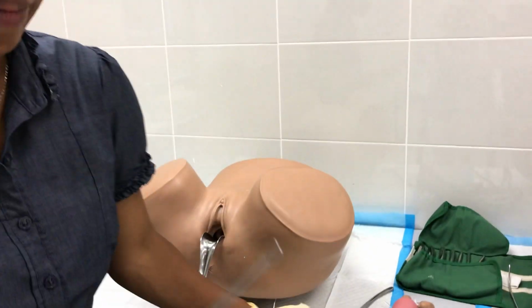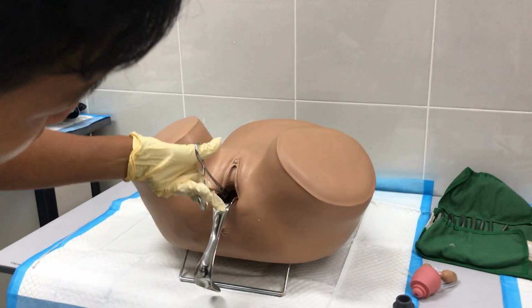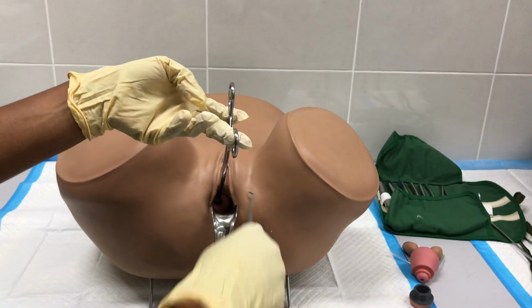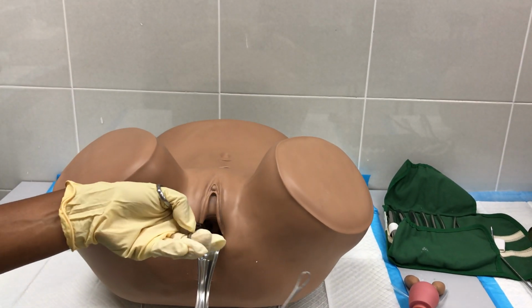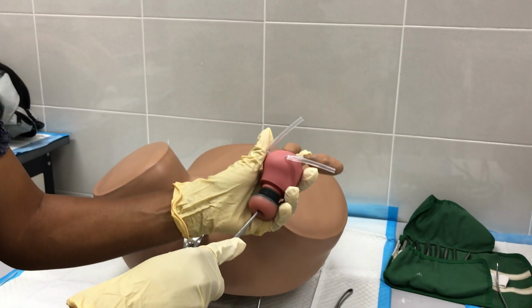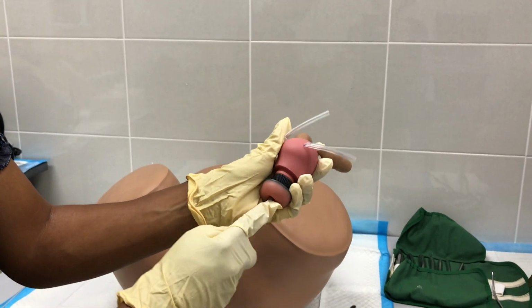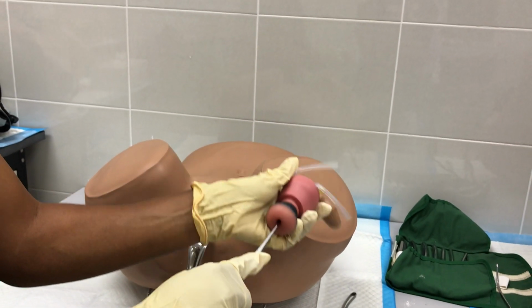At the time when you are about to do the procedure, you can use a volsellum, so that you put the volsellum to the anterior lip, then you pull it there. Okay, and then you have to use this one inside. You have to put it inside and then you have to scrape it. So when you scrape it, it will be this way. Okay, so you put it inside the uterus. Okay, this is the entire uterus. Then when you scrape it, it will be in all directions, anterior, lateral, posterior, in one go. You have to do it.